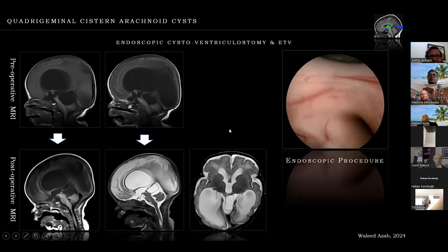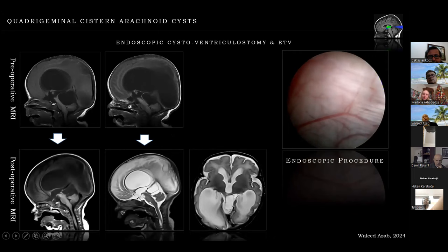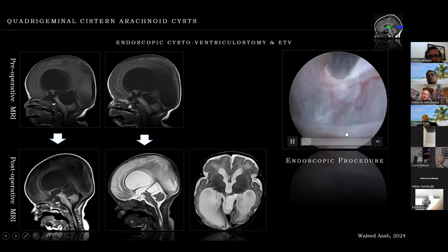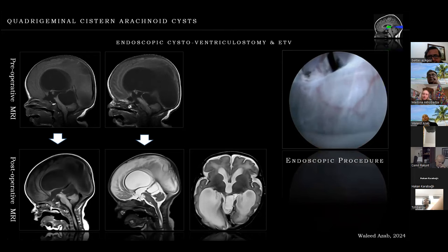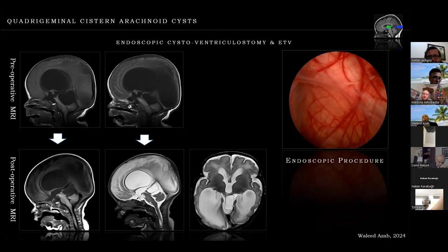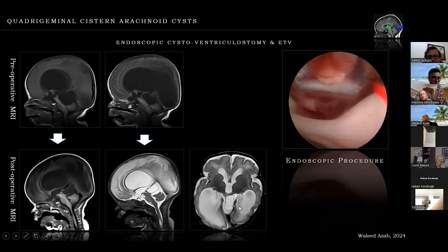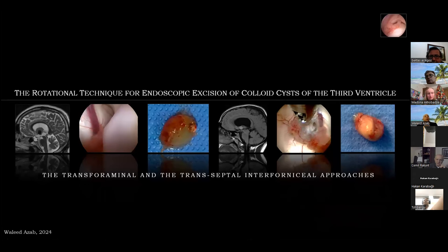These are the images of the patient previously discussed in the context of ETV, who had a quadrigeminal cistern arachnoid cyst. Here is a view into the posterior third ventricle — the membrane in this area is very thick, and bipolar coagulation is used. Scissors complete the opening, giving a view into the superior surface of the cerebellum. The ETV that was previously shown is then performed. Post-operative MRIs are shown.